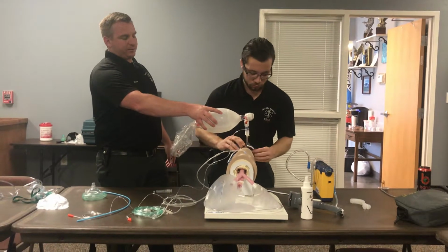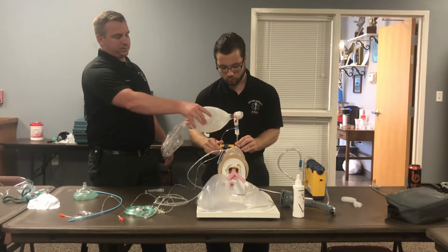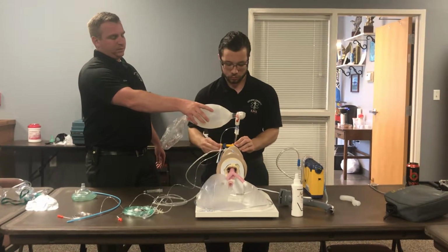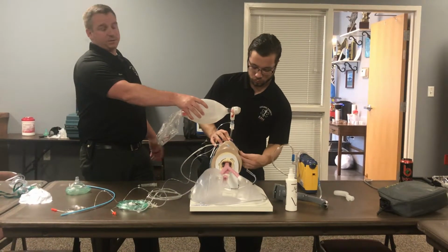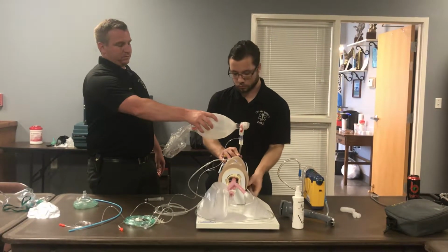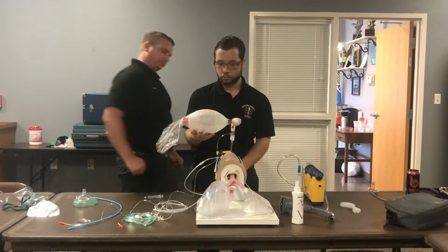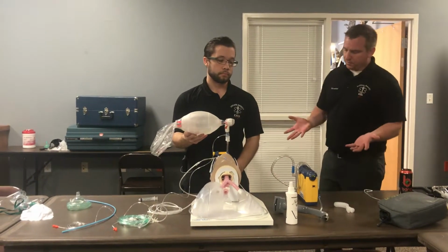And then we don't have one out on the table in front of us, but when Levi's all done securing the tube in place, we're going to drop an NG tube. We encourage you dropping an NG tube anytime a BVM was used, or anytime you intubate, really. Simple procedure. Helps decrease gastric distension, helps decrease the chances of vomit in the airway. Overall good practice.